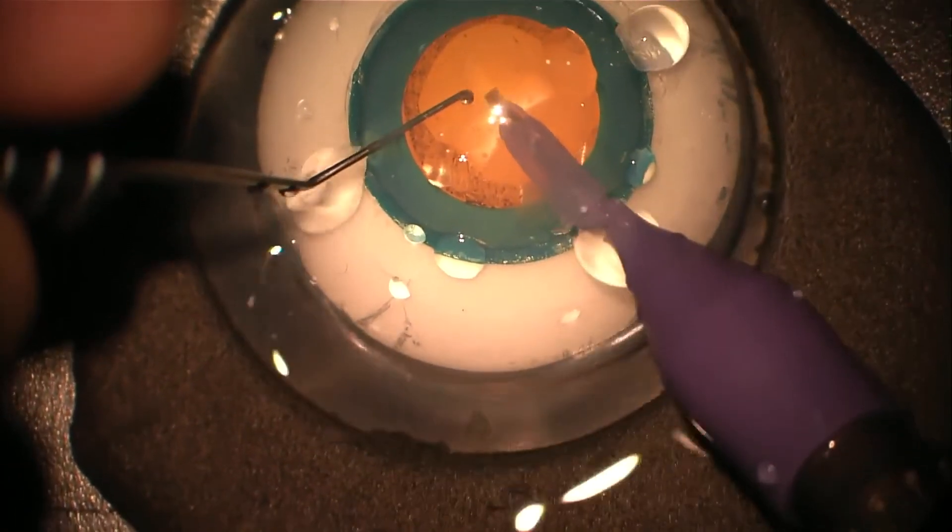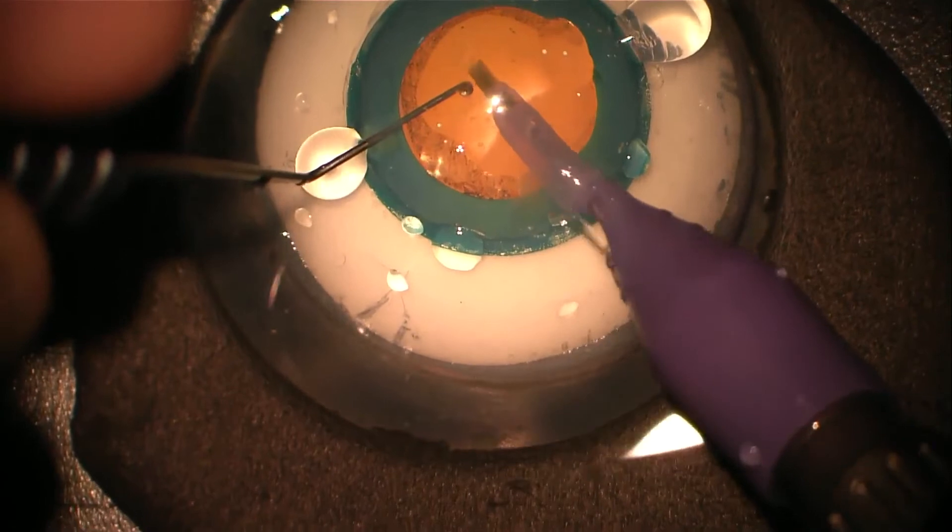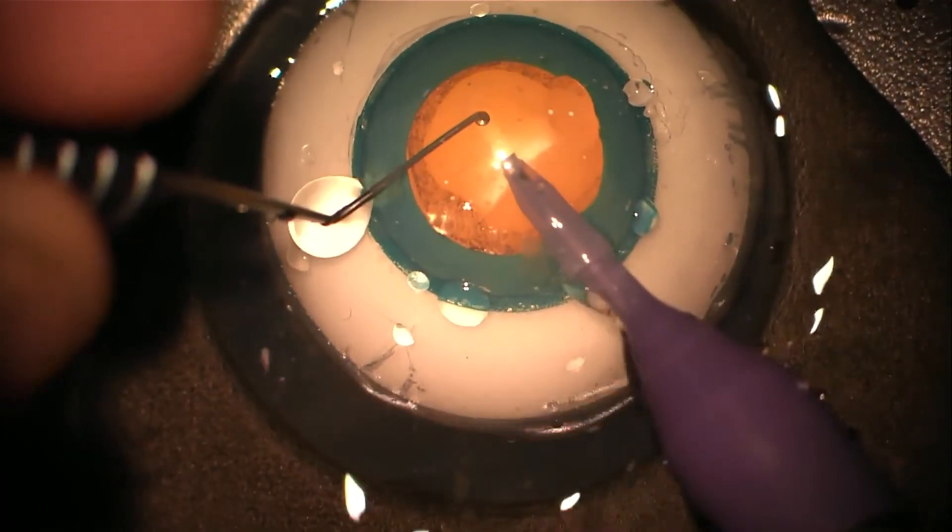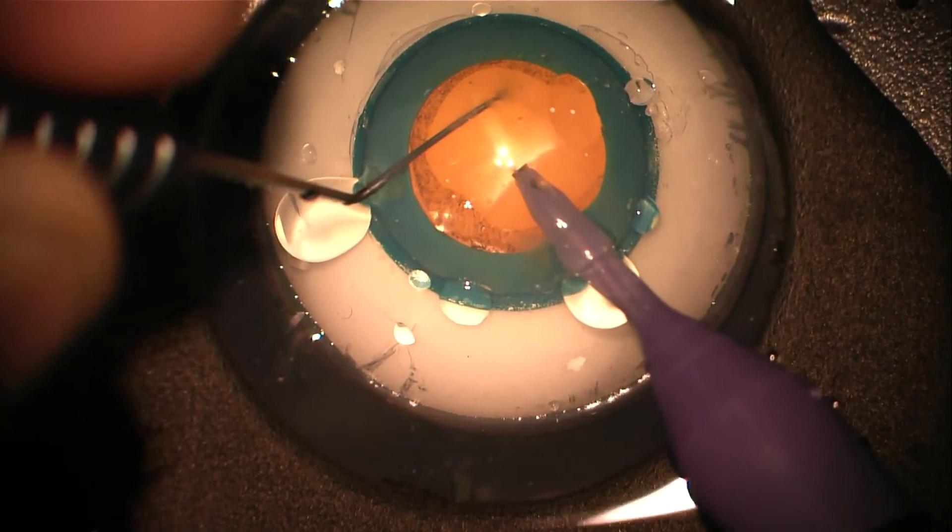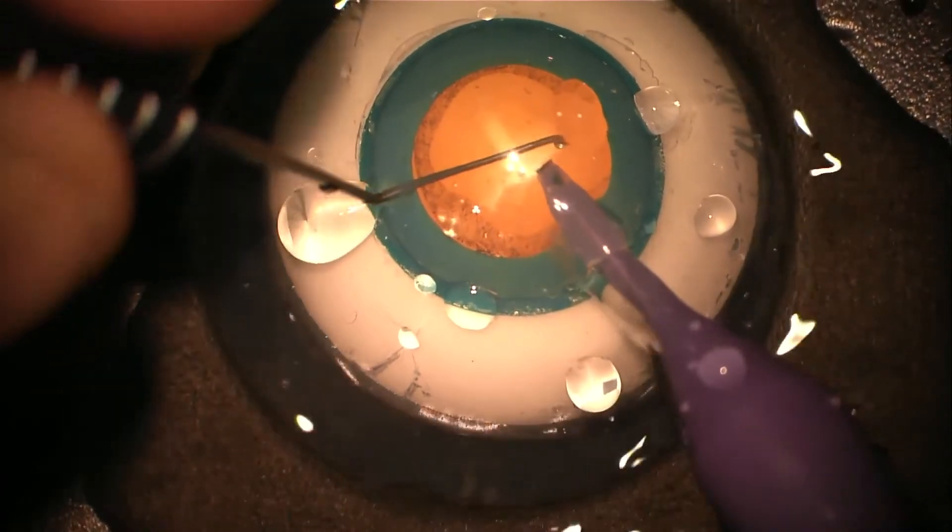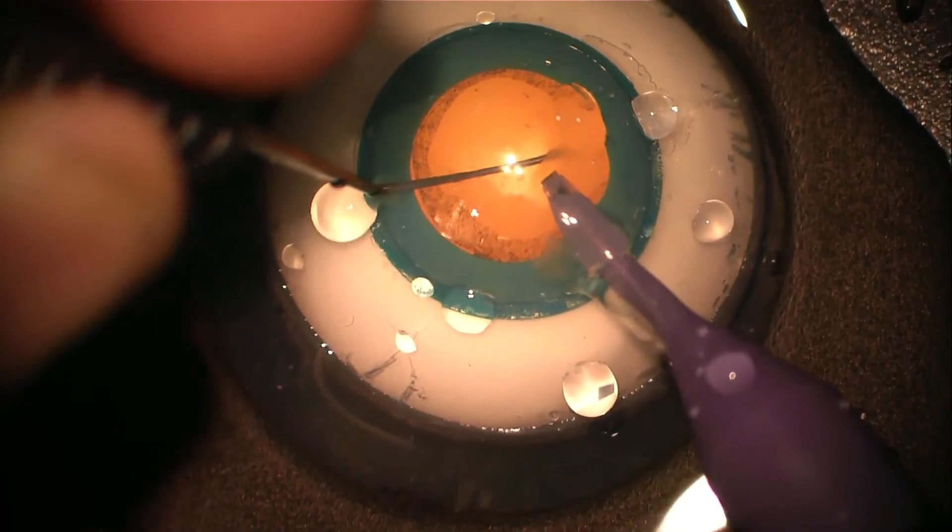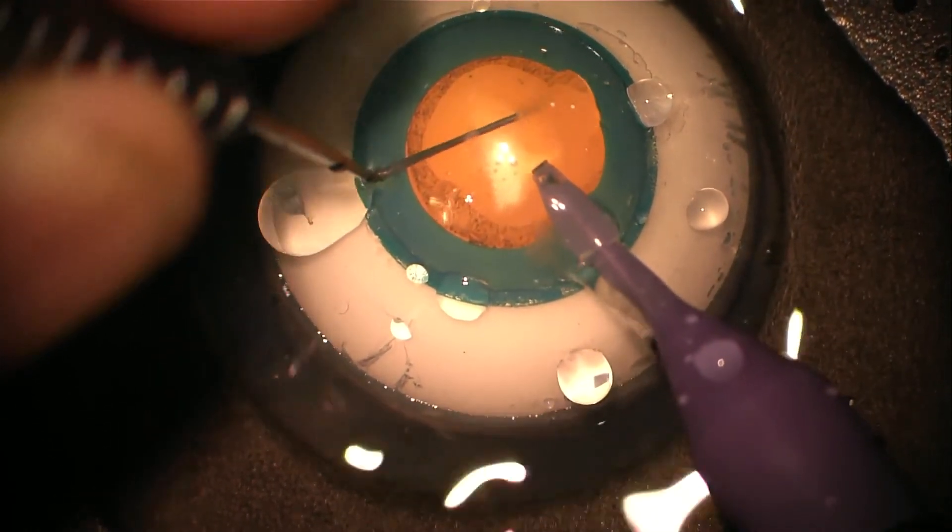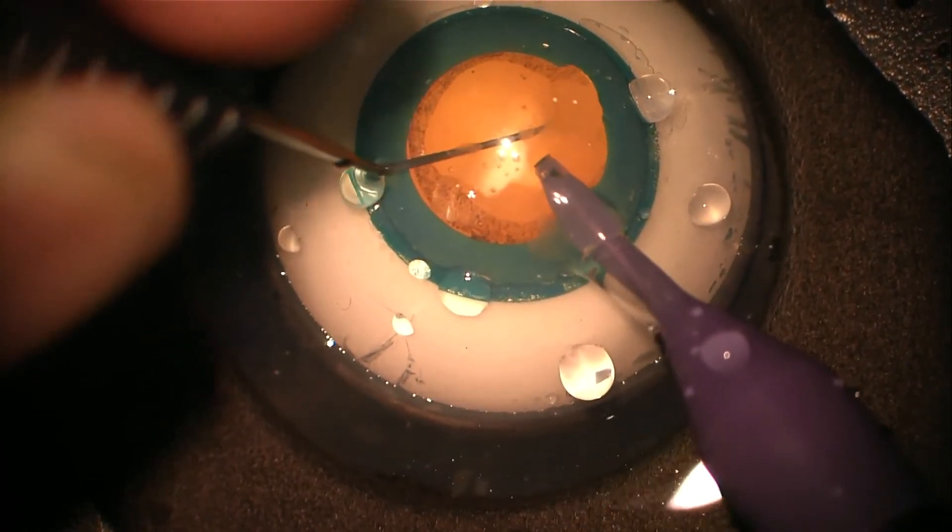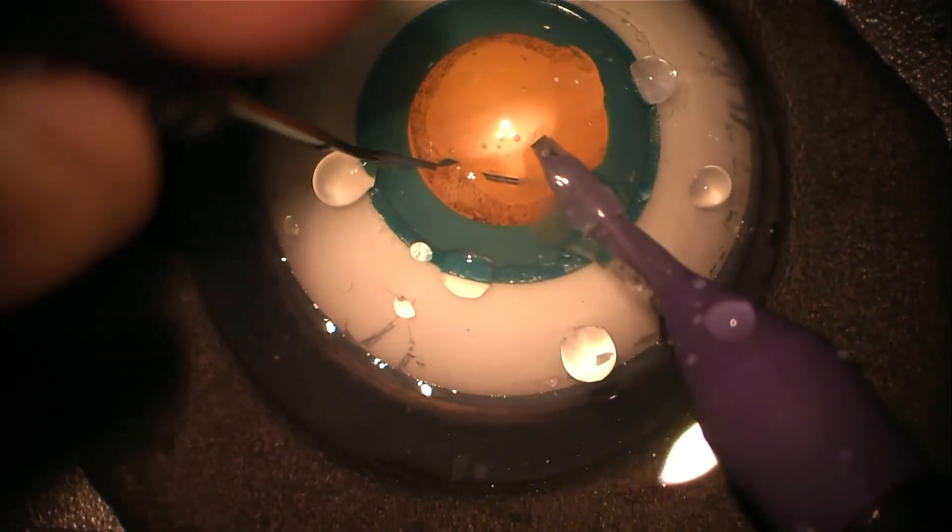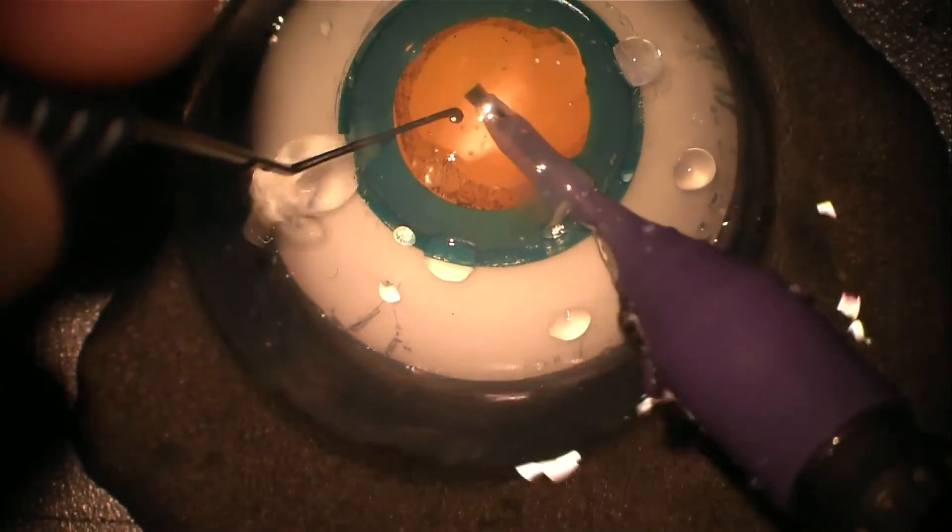Using that two-handed technique to manipulate the lens without putting excessive pressure on the lens, and just rotating again to complete the final bit of sculpting before the nucleus is cracked.